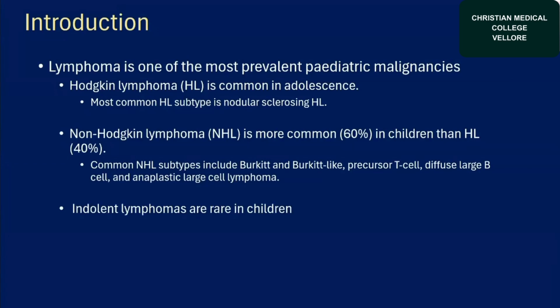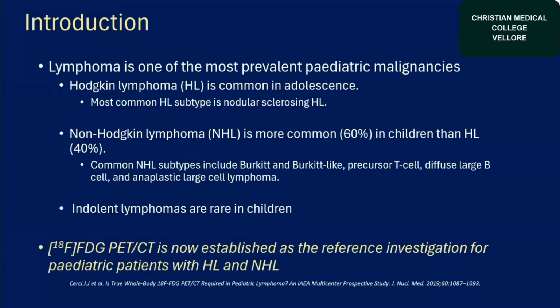Indolent lymphomas in children are very rare, but we know that in functional imaging, F18 FDG, fluorine-18 fluorodeoxyglucose PET-CT is now established as a reference investigation for pediatric patients who are diagnosed with lymphoma.